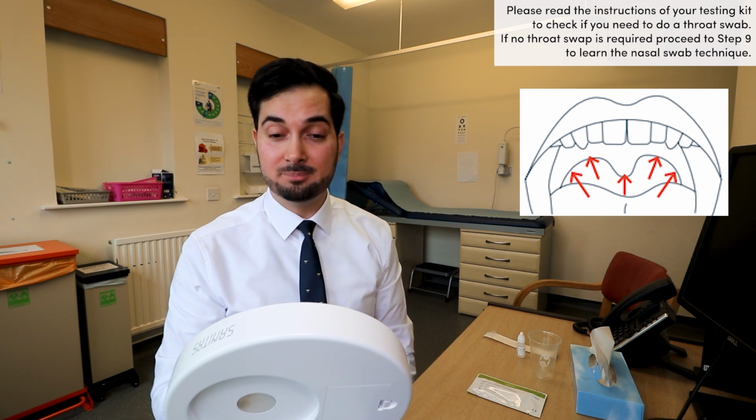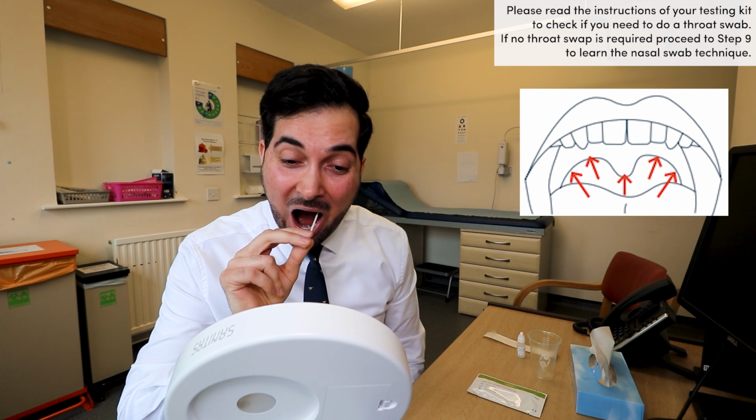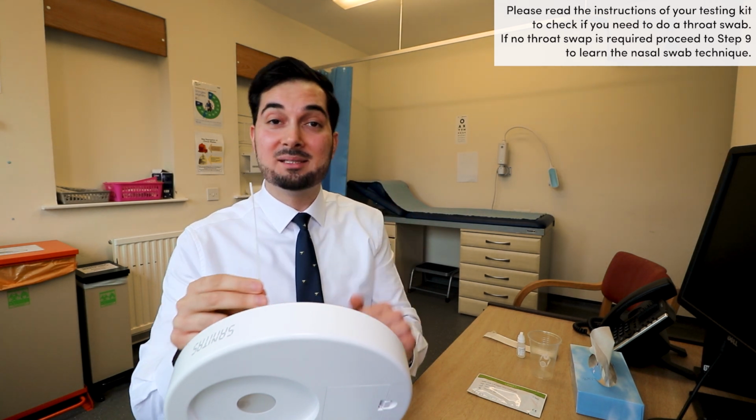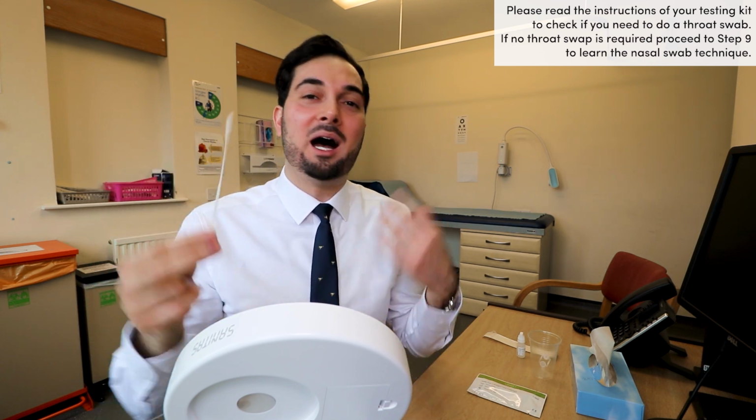So that's the first side done. So that's done. I didn't contaminate it. I went straight to the position it's used to be. You do get used to it. I have done this a lot of times, so I've got very good at it, but I'd highly recommend that you do use the mirror. So that was step number 8.